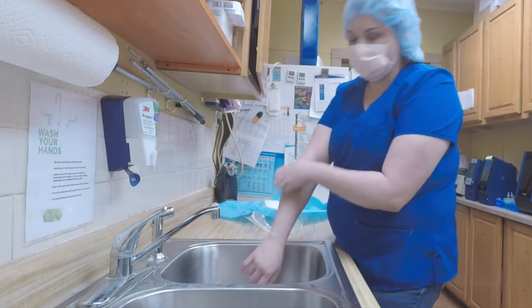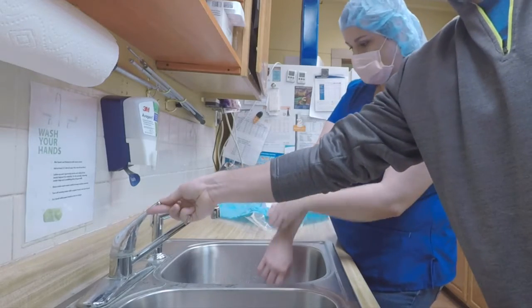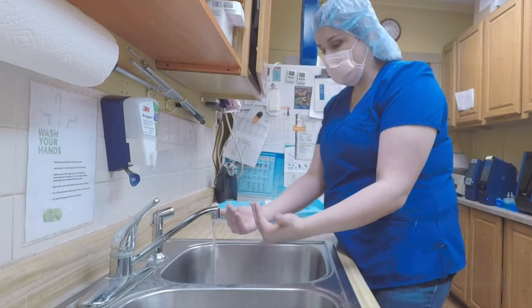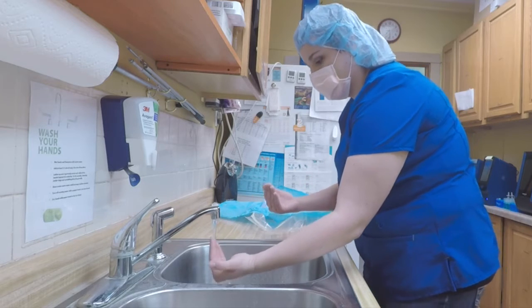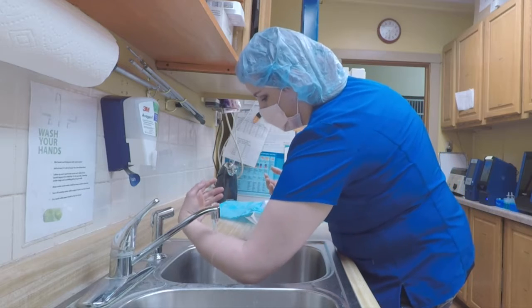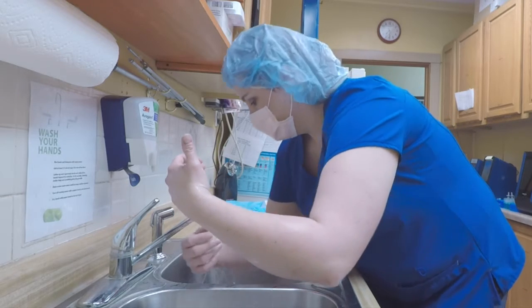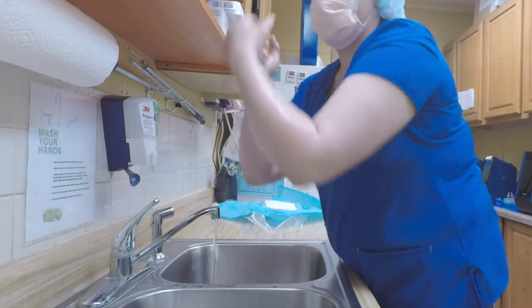And then on the other side, wait, turn the water on for me. And then you want to rinse starting with your fingertips. And then work your way down. Start with one hand. You'll start this way. Letting it all drip to your elbows. And then do the same thing with this hand. Letting it all drip to your elbows.